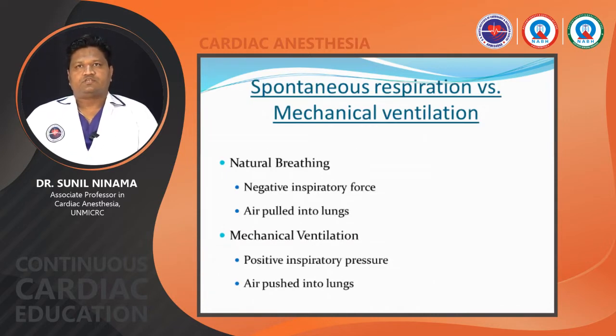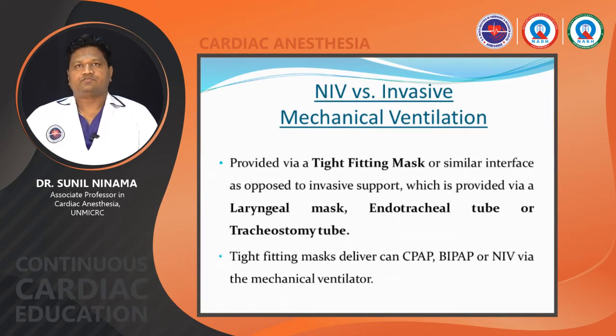What do you mean by spontaneous versus mechanical ventilation? Spontaneous respiration is a natural breath in which there is a negative inspiratory force in the thoracic cavity, which causes air to be pulled into the lungs. That's why it's a spontaneous inspiration. Mechanical ventilation causes positive inspiratory pressure given by the ventilator, which pushes air into the lungs.